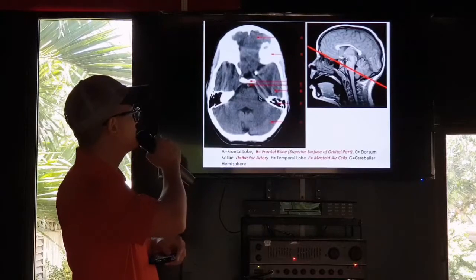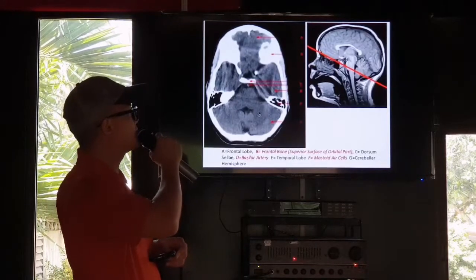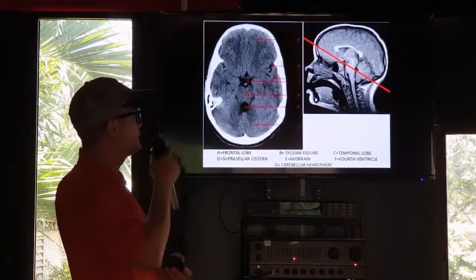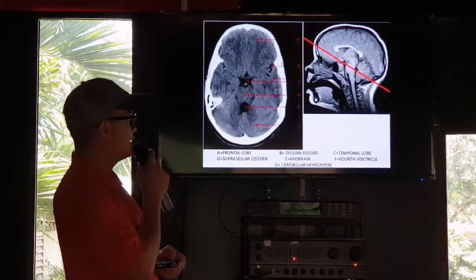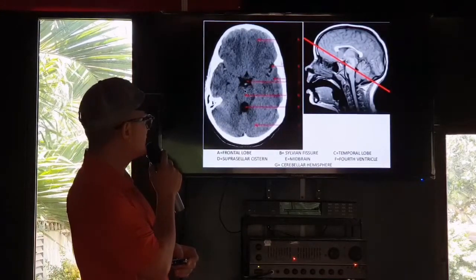Okay, so then you have some of the mastoid air cells, of course, the temporal lobe here, and more superior, the cerebellar hemispheres. For this cut, this is around the level of the midbrain, above the pons. You have the frontal lobe, the suprasellar cistern here.